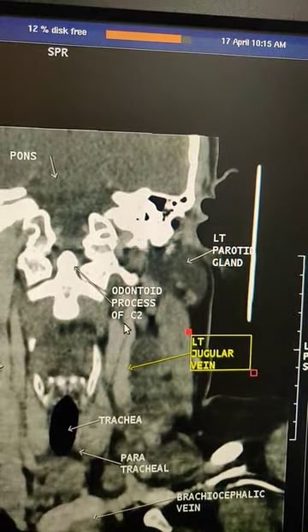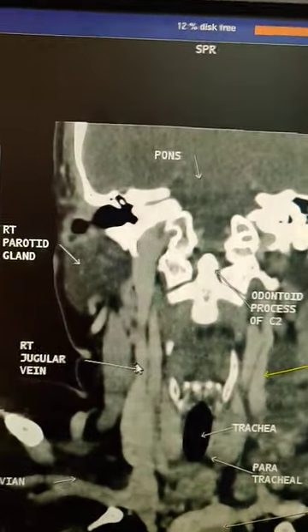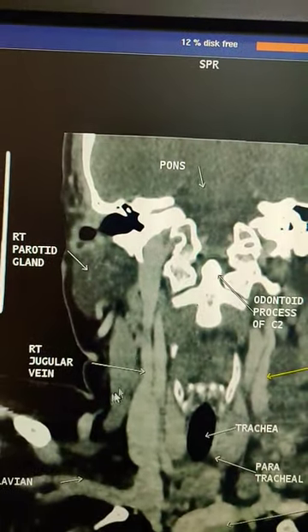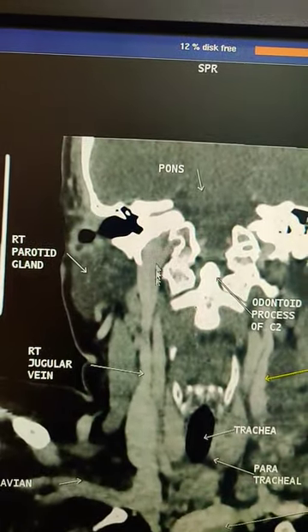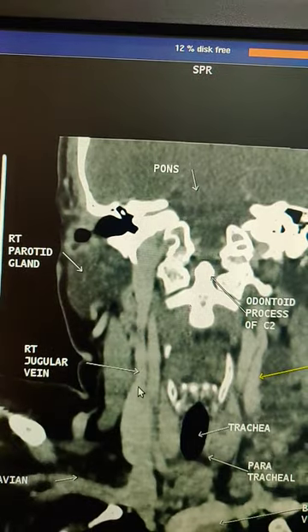Jugular vein. This is the jugular vein. Same area. Right jugular vein.